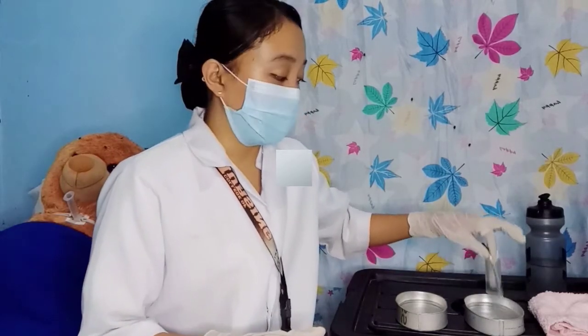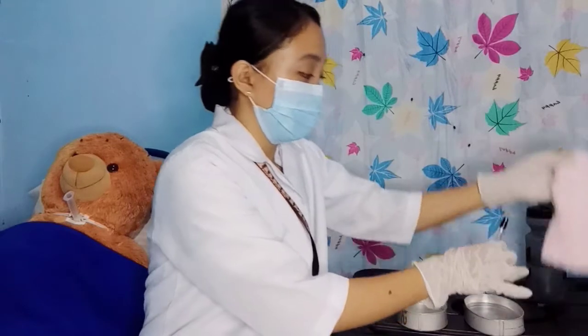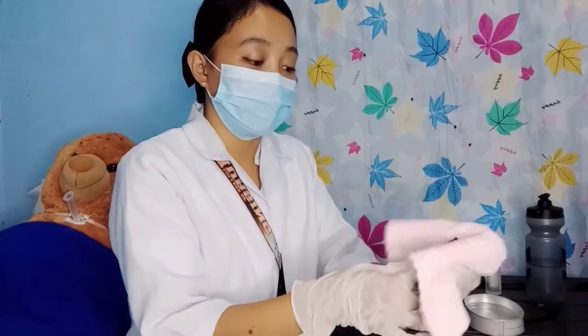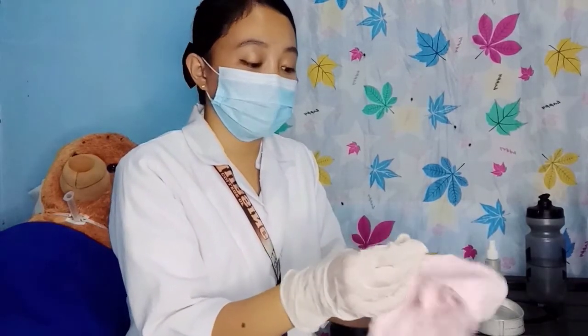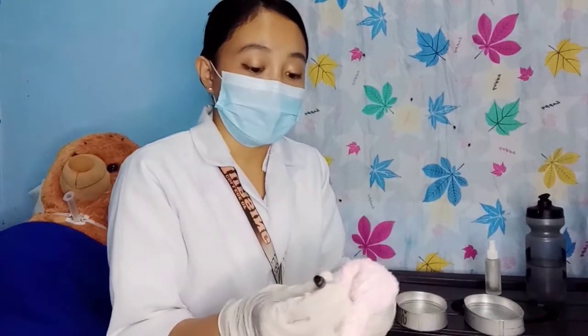Discard gloves and put on another pair if necessary. After soaking in the PNSS, take out the inner cannula and dry it using sterile gauze or a pad — tap gently. Make sure it is completely dry before reinserting it into the tracheostomy.